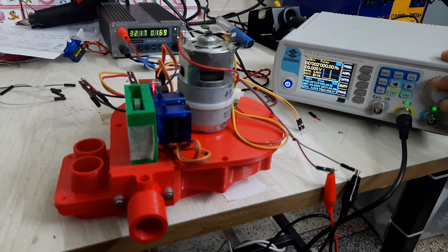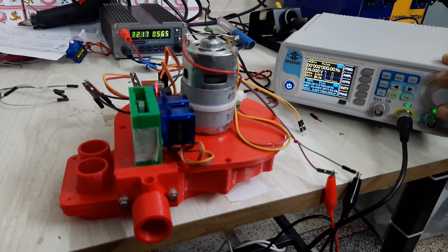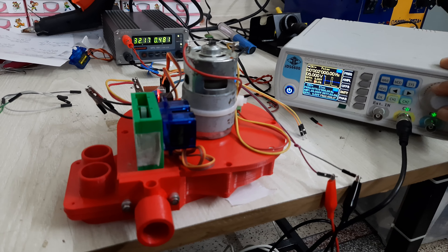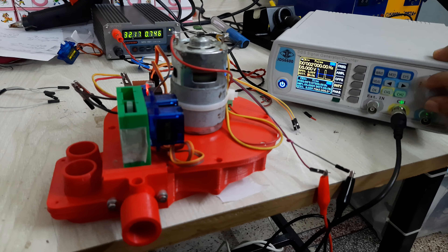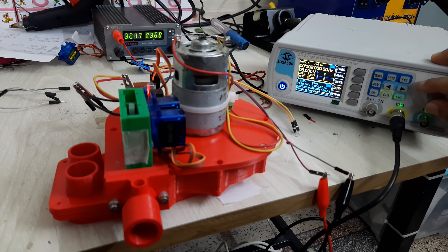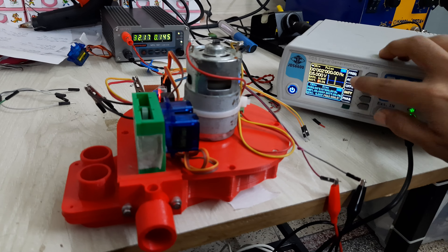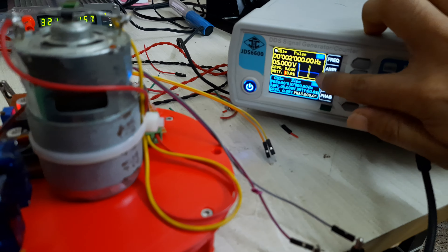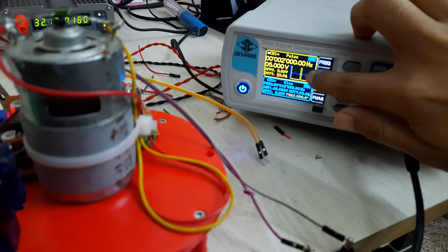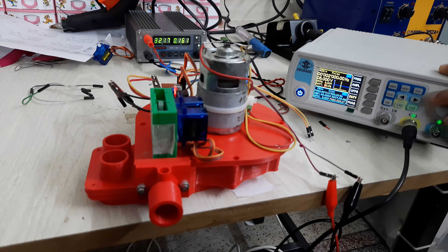Now I am changing the duty cycle — this is 10%, 20%, 30%, and now back to 10%. Here you can see the duty cycle, and here is the response.